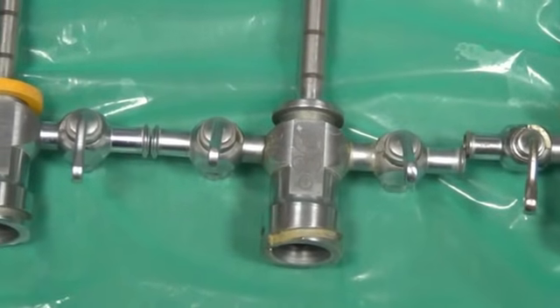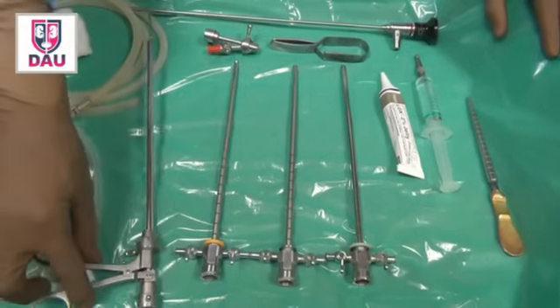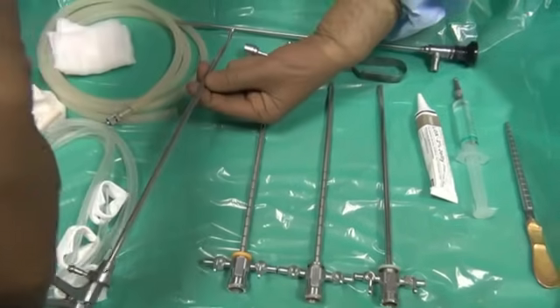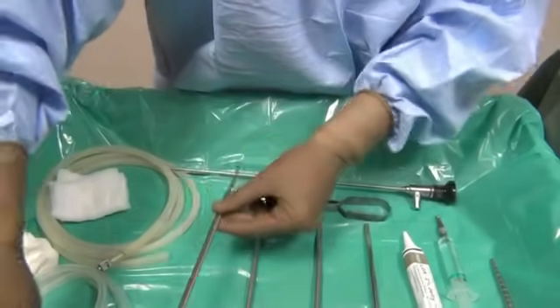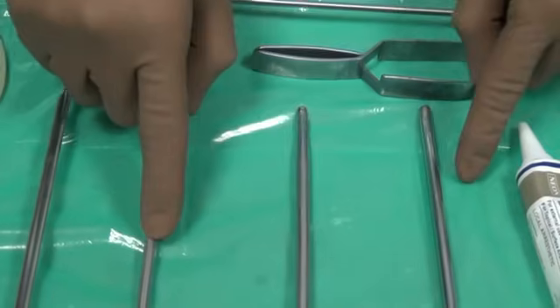If you are doing a urethro-cystoscopy only for examination under local anesthesia, it is better to use a 17 French sheath. But if you think you need to do a biopsy of the bladder, you need to put in a biopsy forceps as well — a cold cup biopsy forceps — which should be ready on your trolley. You can see how the cups open and close. This cold cup biopsy forceps will only go in the 19 French sheath or greater, not with the 17 French sheath.